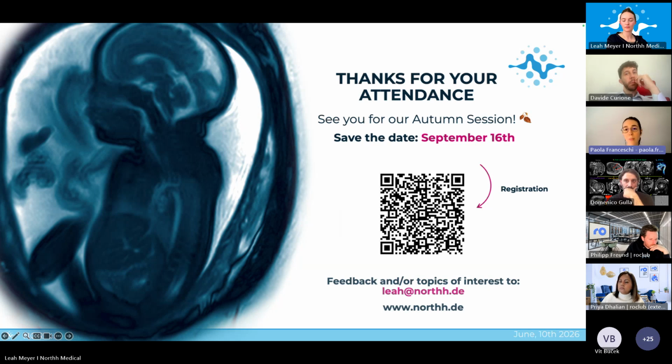But I know that there are some centers that are lucky enough to be able to use lighter coils, but we are still using that one. We are managing to use it, and moms don't complain so much. But obviously, if you are able to use lighter coils, probably it's better.